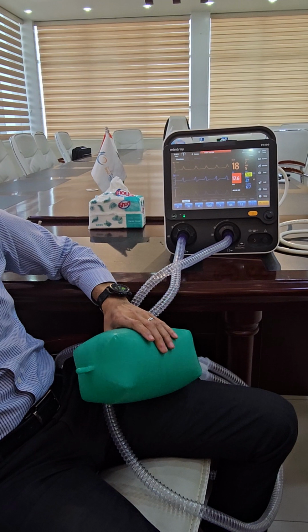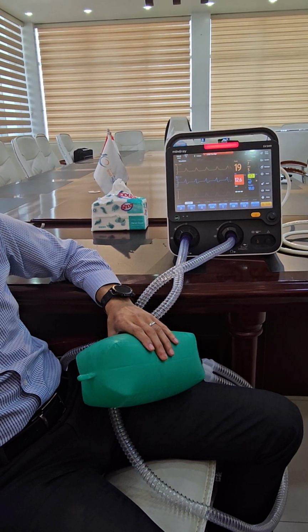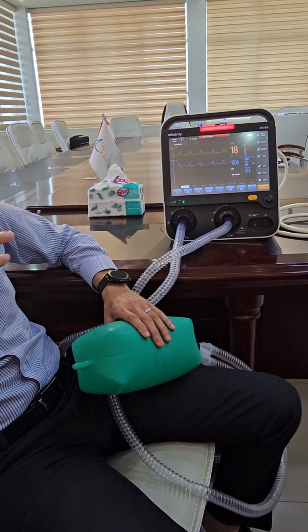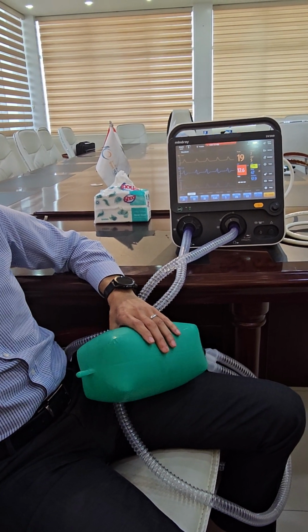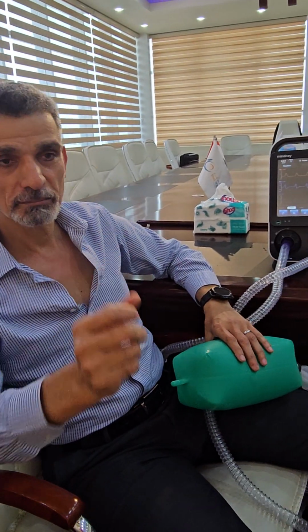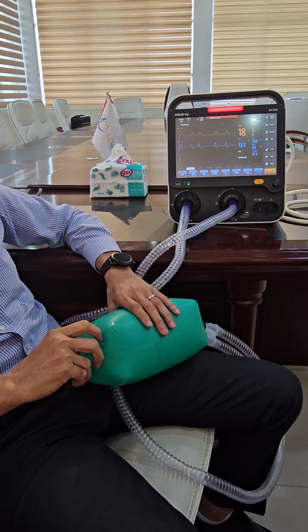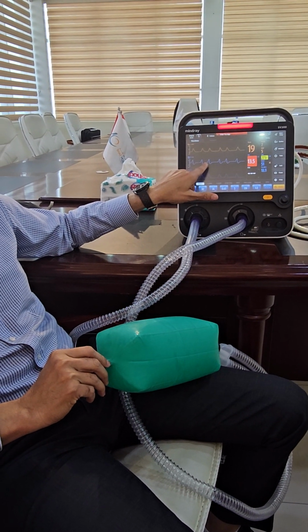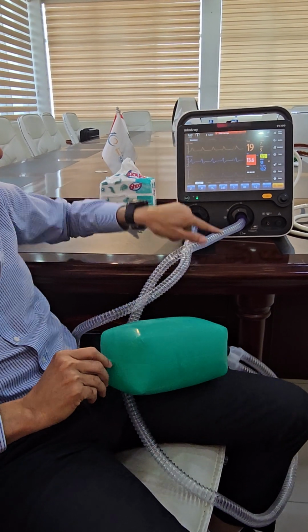Now when you want to blow a balloon, how do you blow the balloon? Try to blow a balloon right now. Put your hand and pressure. This is pressure, just pressure. So you blow the balloon, you need time. Time and pressure. But if you want to blow it away at once, so if you see this, this is pressure control. You see, up and down.